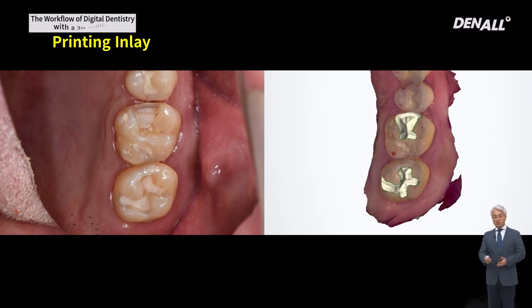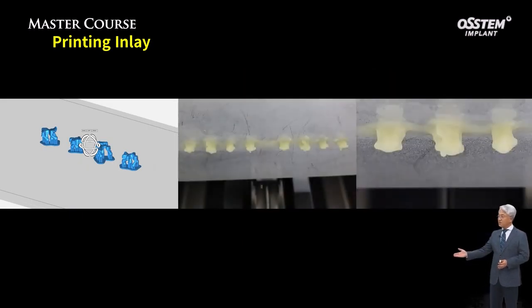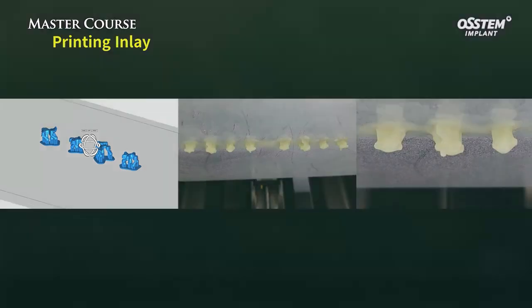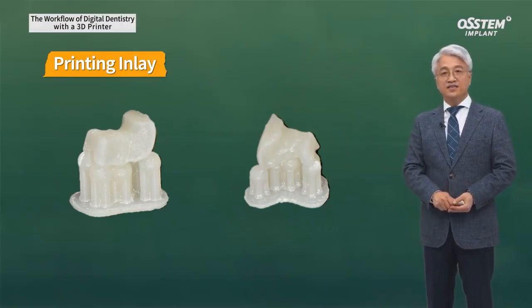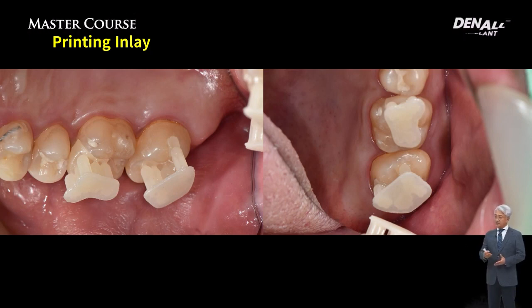Inlay design is done. Image slicing software was used to slice the CAD/CAM. You can see that the inlay has been fabricated as shown. After post-processing, as you can see, the inlay has been 3D printed. It has been delivered to the patient. The fit looks slightly wrong. However, when I did setting further, it was okay.